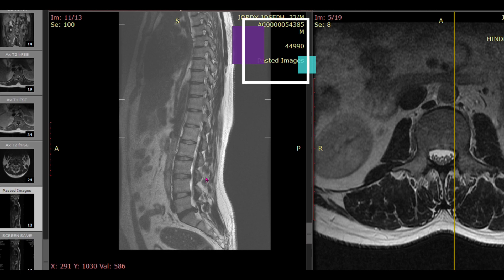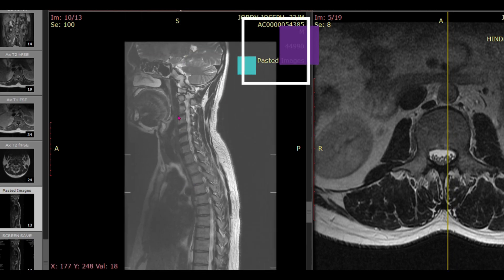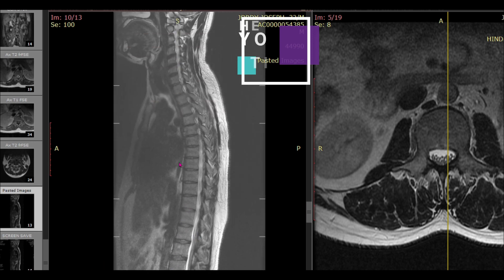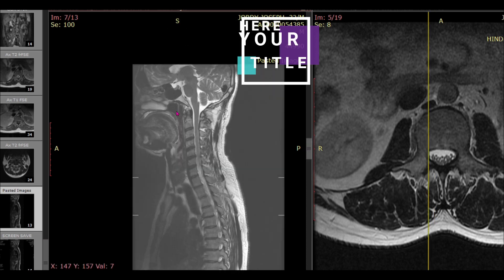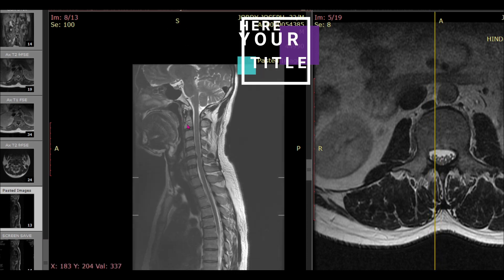There is no sacralization, so that part is ruled out. Now regarding the lordotic curvature, it is almost normal and there is no kyphotic deformity anywhere. The dorsal spine is fine as well. Generally in our center we do reporting on two sets — a main study of the particular part of interest, and a screening of the rest.